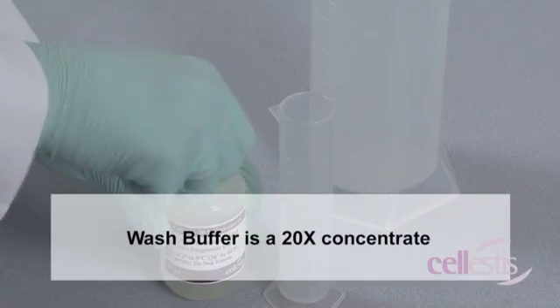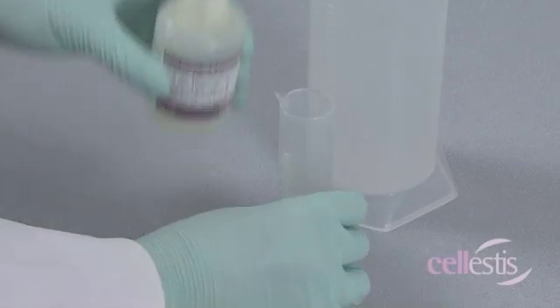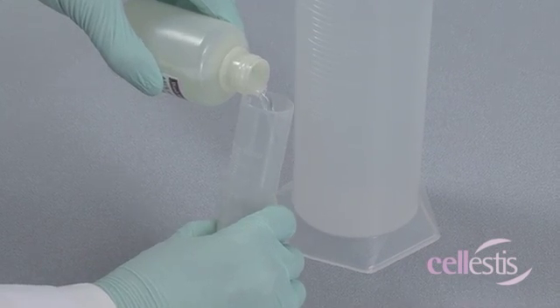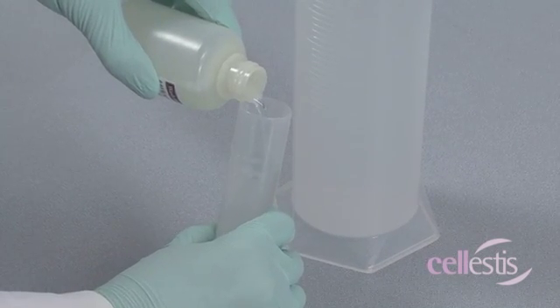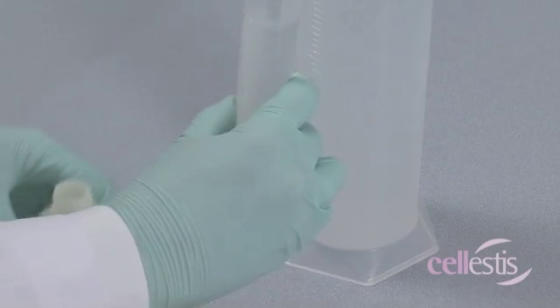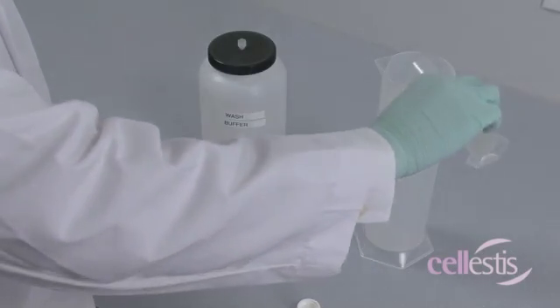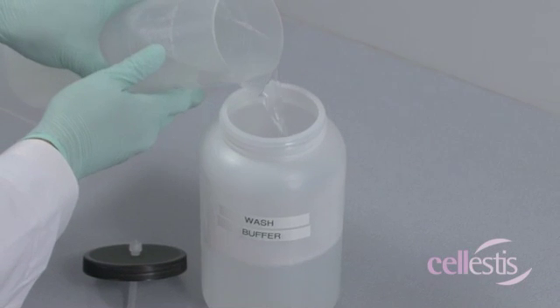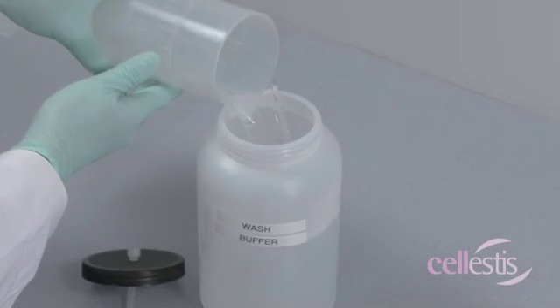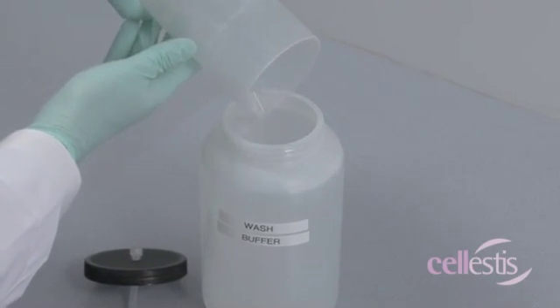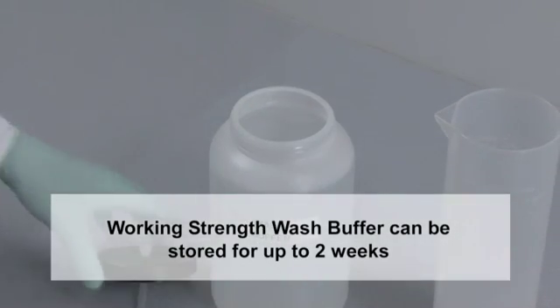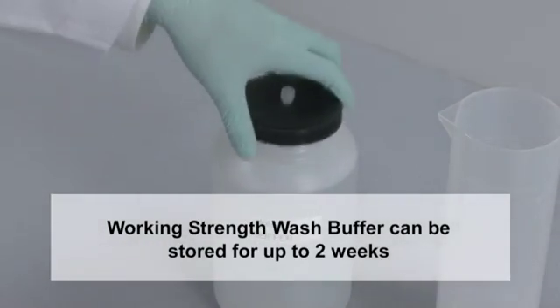The wash buffer is a 20-time concentrate. It should be prepared by diluting one part of wash buffer concentrate with 19 parts distilled water and mixing thoroughly. Enough concentrate has been provided to allow for one liter of working strength buffer per ELISA plate. Once diluted, the working strength wash buffer can be stored at room temperature for up to two weeks.